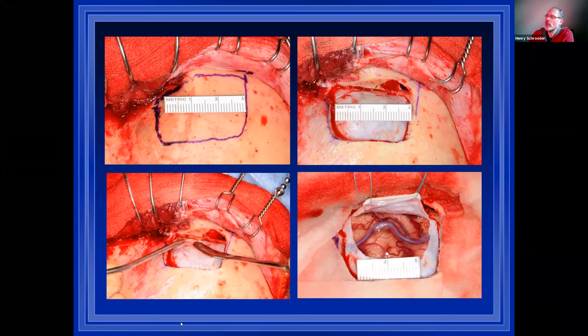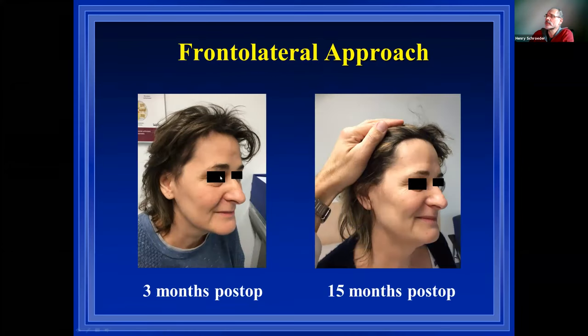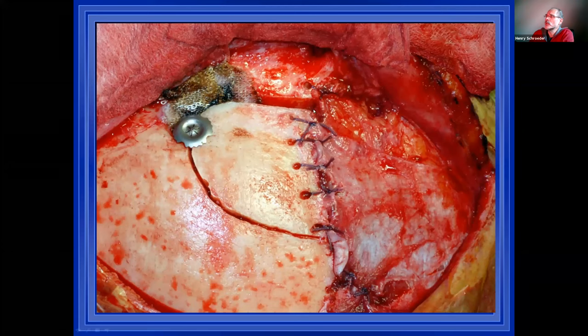So if we have a large opening into the frontal sinus, then the best incision is behind the hairline, because you can harvest periosteum and muscle. And you see, even if you make this old-fashioned incision behind the hairline, you can have a good result with not much muscle wasting if you take care of the muscle innervation and blood supply. We tried to improve our cosmetic results by not cutting through the muscle, but detaching it from the temporal line and retracting it laterally. And then we resutured it. But in my opinion, we found that the cosmetic result is better if we simply make a monolayer flap.